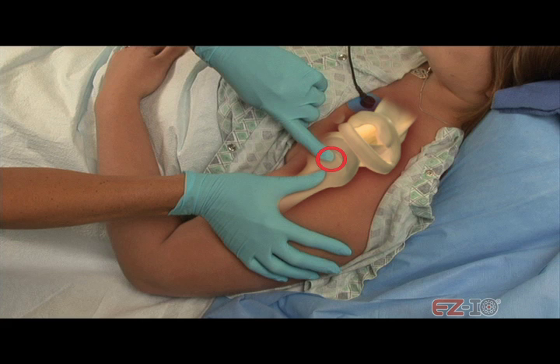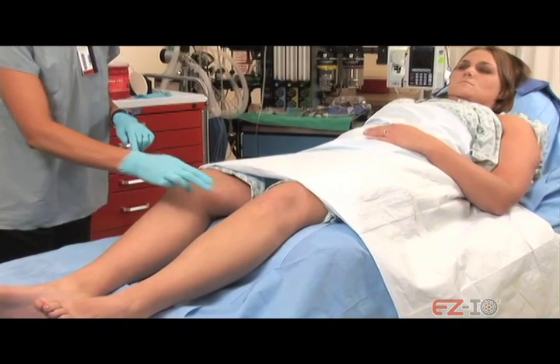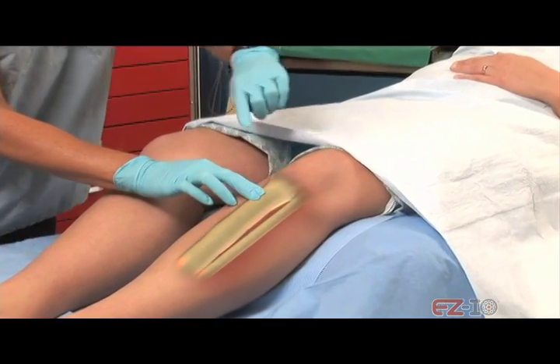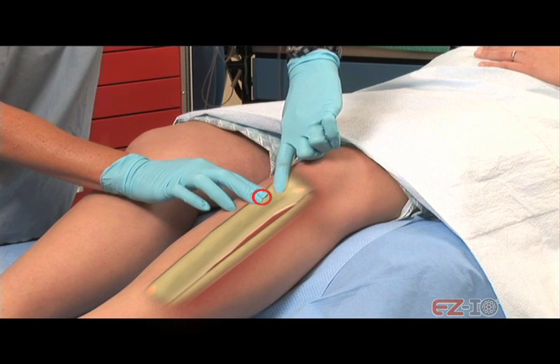VitaCare recommends the 45 millimeter needle on patients weighing more than 40 kilograms. The humerus is the preferred site for patients who are responsive to pain. Once the insertion is completed, secure the arm in place to prevent movement and accidental dislodgement of the IO catheter. The proximal tibia insertion site is approximately 2 centimeters below the patella and approximately 2 centimeters medial to the tibial tuberosity, depending on patient anatomy.